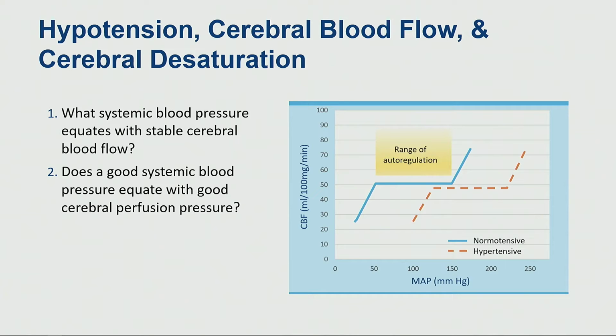We will often be at a MAP of 65. We feel that cerebral blood flow is stable and we're in a good place. However, our patient has been carrying hypertension for 30 years, this MAP of 65 may no longer generate adequate cerebral blood flow for our patients.